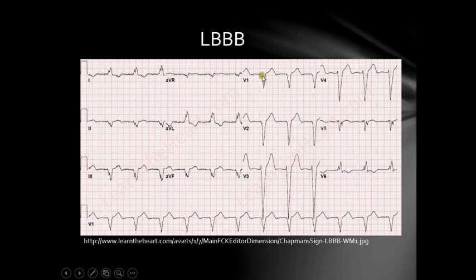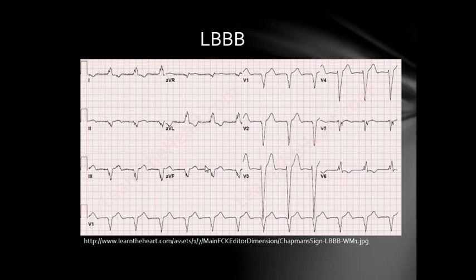We can also see a deep, broad S-wave in V1 and V2, which are looking at the right ventricle. And lastly, we see left-axis deviation: lead 1 is looking upwards, whereas leads 2, 3, and AVF are facing downwards. Left bundle branch block is particularly important to pick up because a new left bundle branch block could be a sign of acute myocardial infarction, whereas a pre-existing left bundle branch block could mask the signs of an acute myocardial infarction — so for both reasons, it is important to identify.